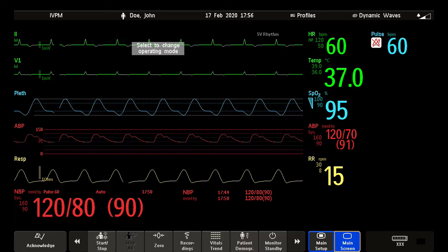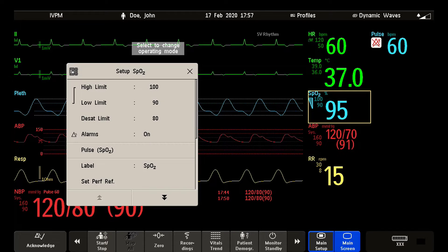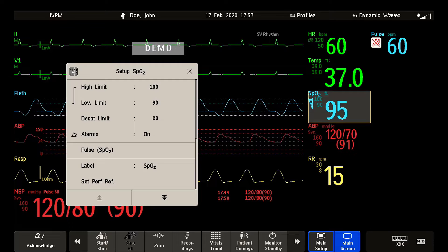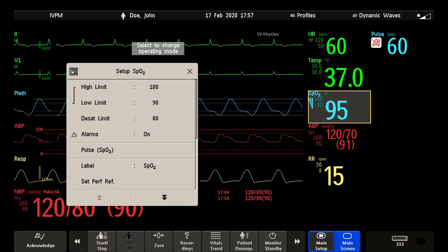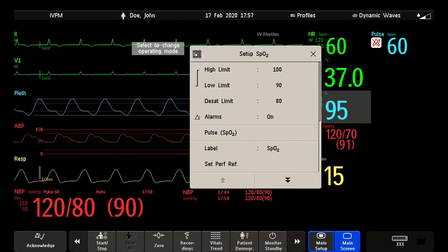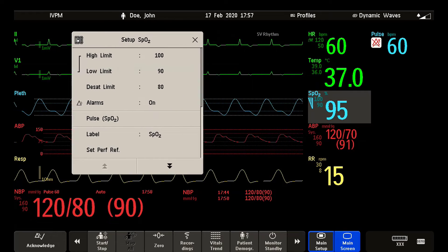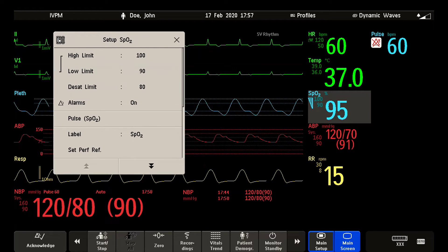It may be nice to know — you can also move a window, for example, when it covers something you want to view while the window is open. Select the title of the window, keep your finger on the title, and then move the window away. The new position is only active until the window or menu is closed.